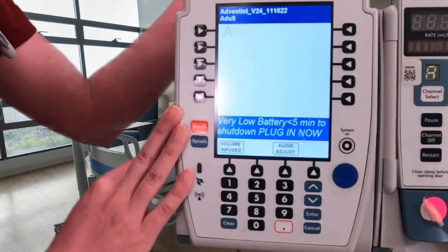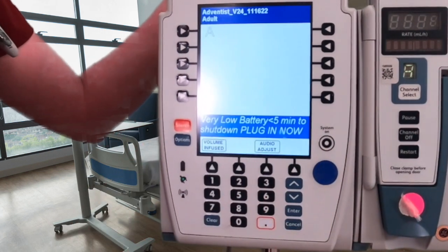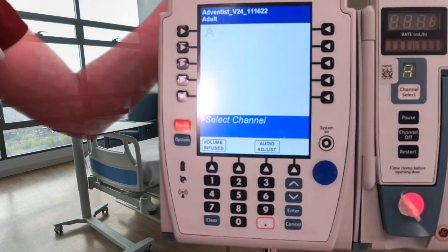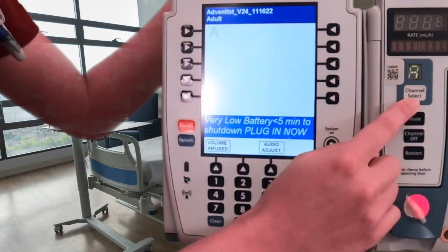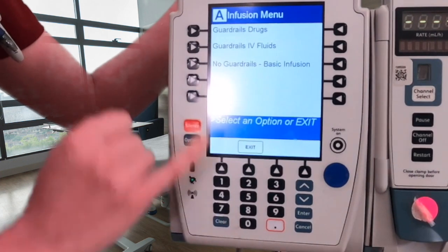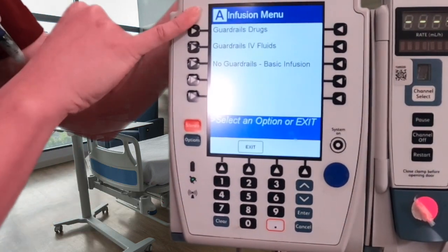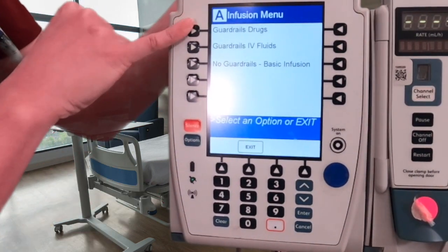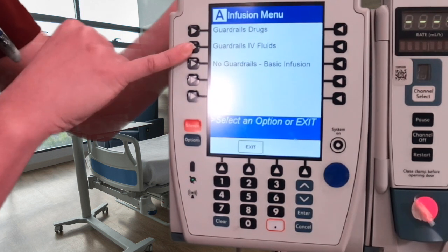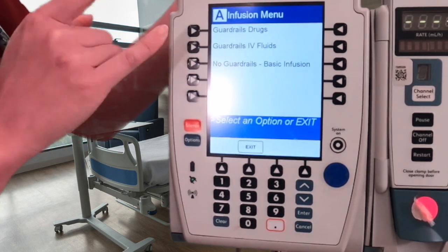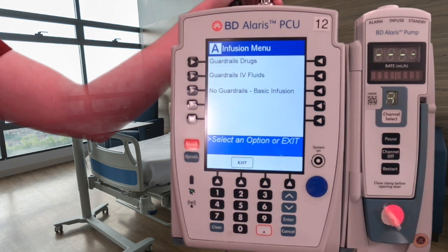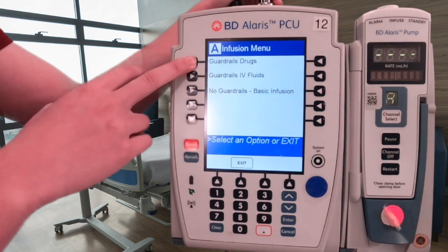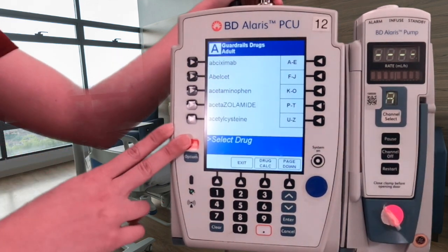Now we are at our main page and it will say 'Select Channel' — this is how we program. To program, press channel select. Now we have three options: Guardrail Drugs, Guardrails IV Fluids, and No Guardrails. If your doctor has ordered Tylenol, potassium, or a secondary fluid such as an antibiotic, you would go into Guardrail Drugs — this is where you would find all your medications.